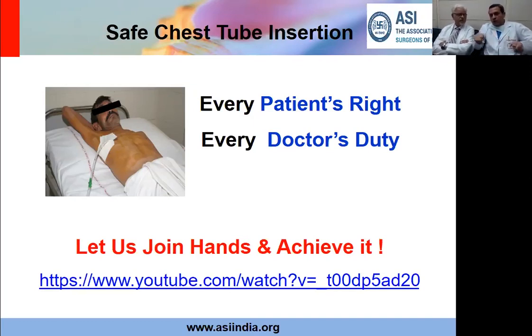If we have put a purse string and the purse string is very nicely closed, then you need not put an occlusive dressing. We just put a Tegaderm or a small gauze piece and ask the patient to remove it after 48, 72 hours. Then this can be left open and we remove the stitch on the 8th or 10th day. But if I have not been able to tie the purse string and I put an occlusive dressing there, we remove it on the 4th day. By the 4th day, usually that hole would have closed. But if we have any doubt, after the 4th day removal, you put another occlusive dressing for another 48 hours, by which time the hole normally closes on its own and then there is no possibility of air being sucked in. Well, very nicely explained.